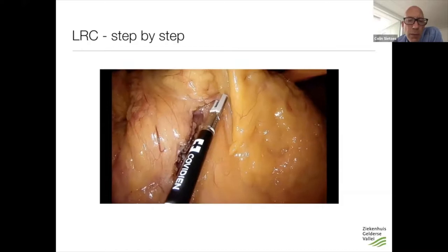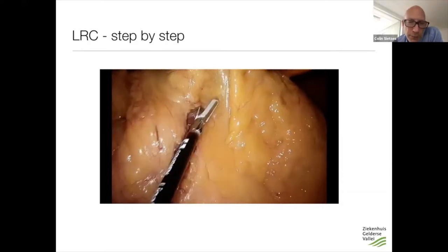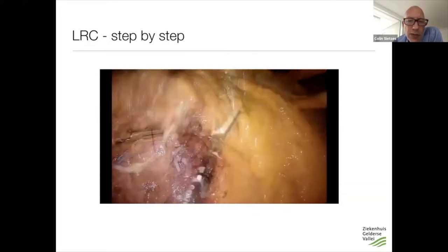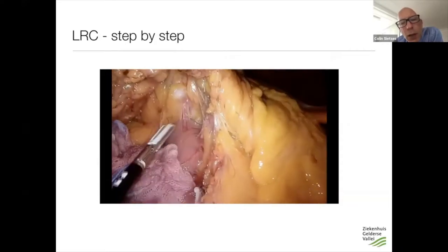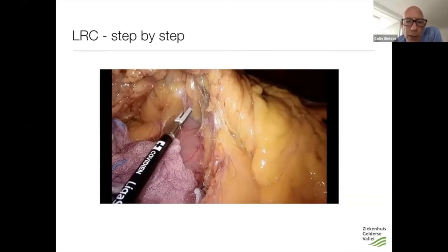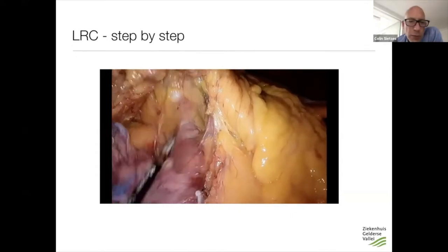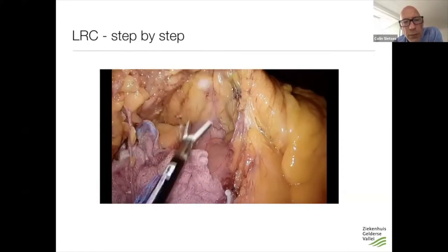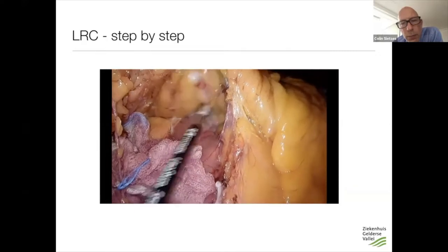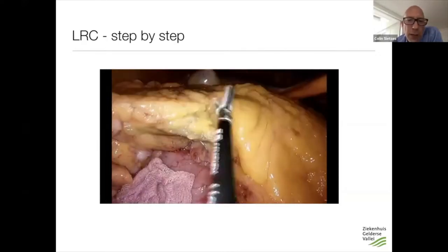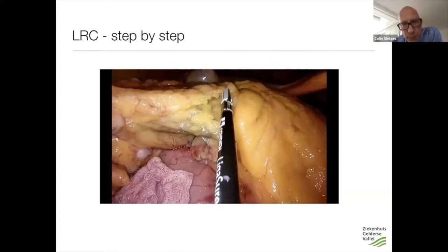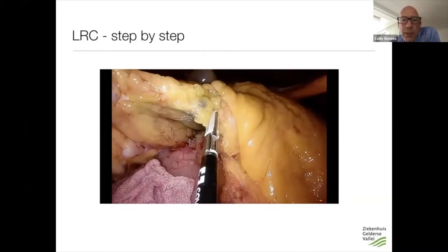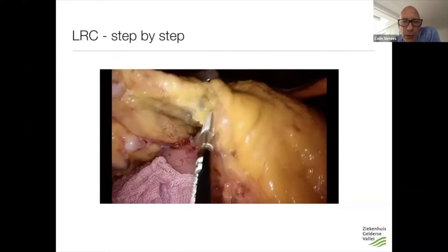In this case we look for the right branch of the middle colic artery. I know the dissection is done more centrally by Andreas and Walter. You can see an evident lymph node metastasis here. We follow it up and free the last adhesions. These are the last transverse mesentery attachments. This is the middle colic artery, or the right branch of it.